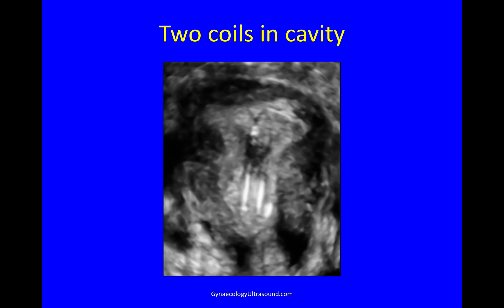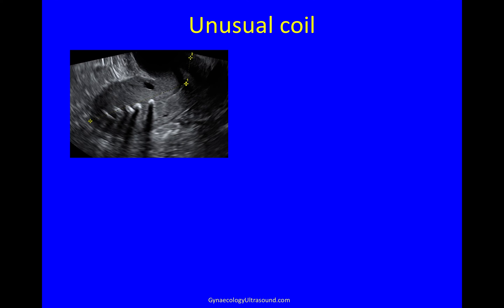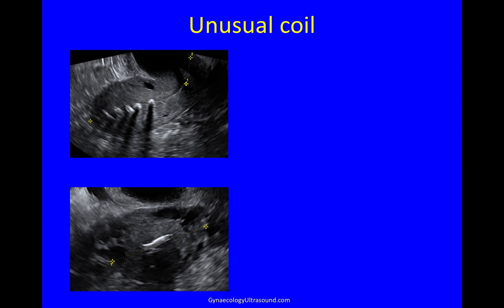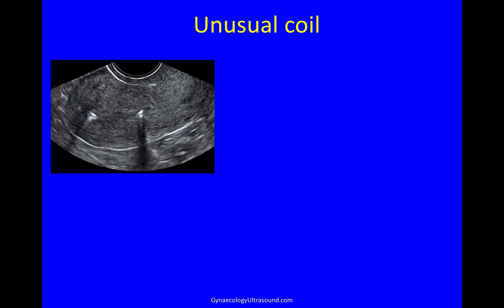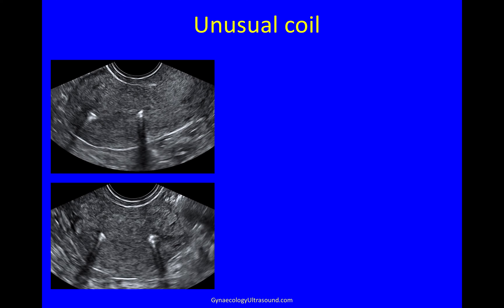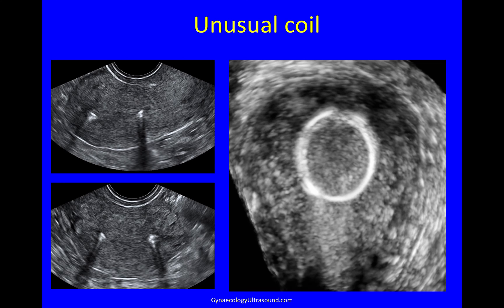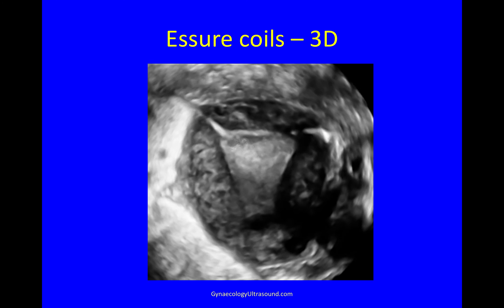Sometimes you see two coils in a single cavity, or unusual coils that are hard to identify on the transverse view. On 3D this is revealed to be a Lippes loop. In another case, the coil type was unclear, but 3D showed a metal circular coil — these are harder to remove. This is an example of Essure coils, small metal inserts into the interstitial portion of the fallopian tubes, whose position can be checked using 3D ultrasound.